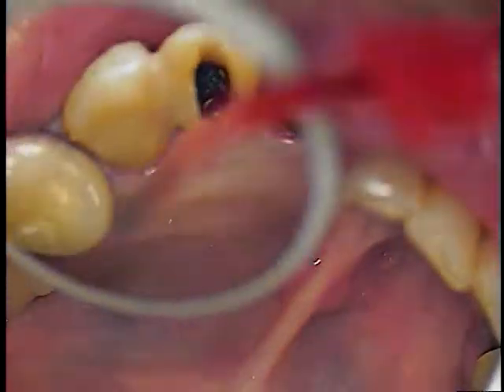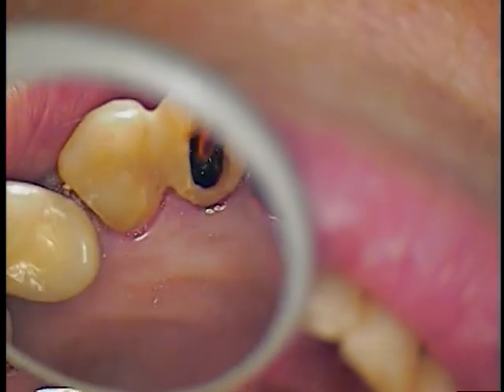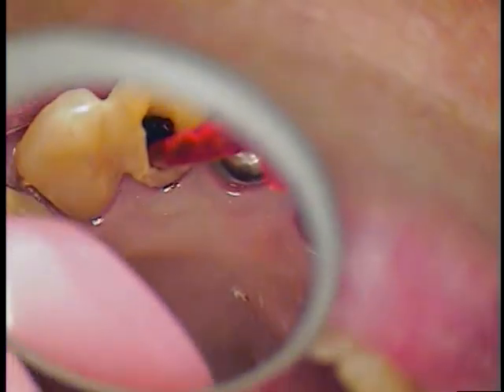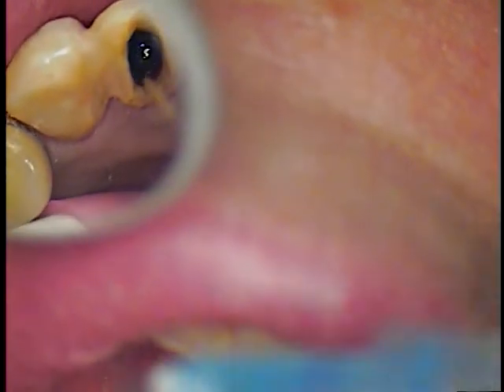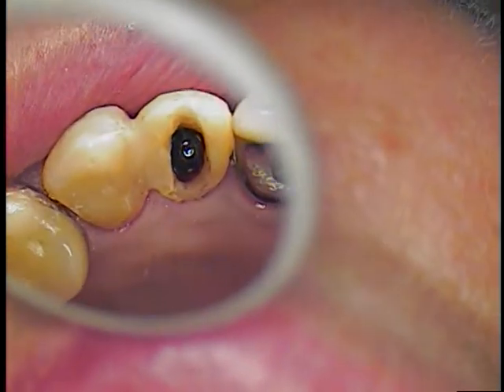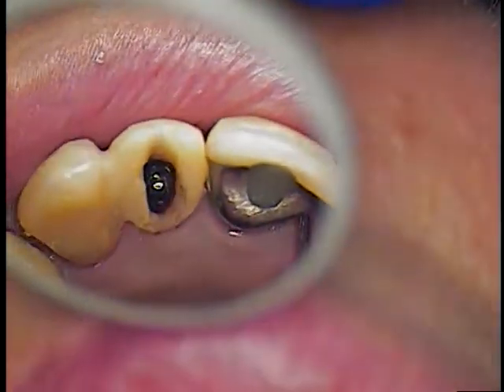Okay, here we go. Just a little on a brush just because there's so much metal flying around in here from prior access. We'll switch it back. Not even close on the length. So I'm going to go back in. Put a drop. Okay, drops in. Now, microsuction, and hopefully the lesson learned here is we'll get a micro brush ready.